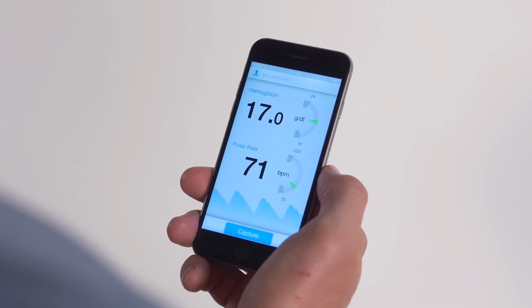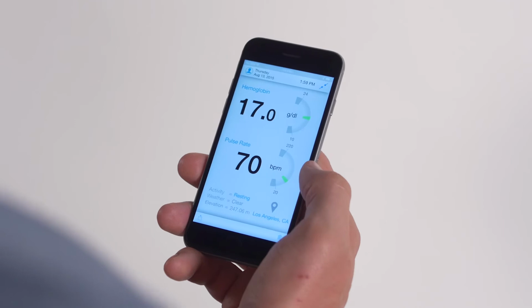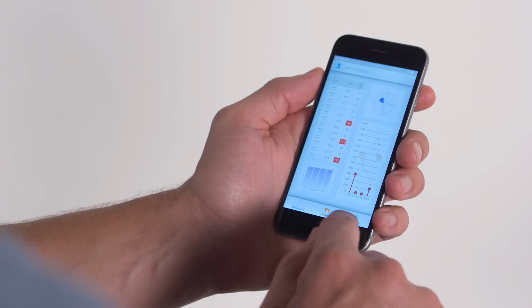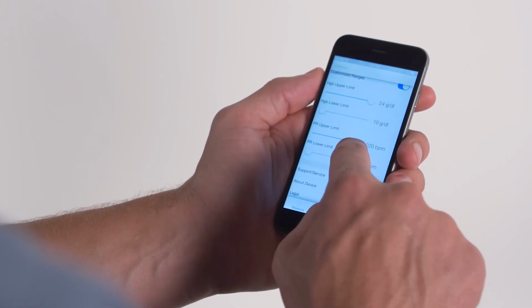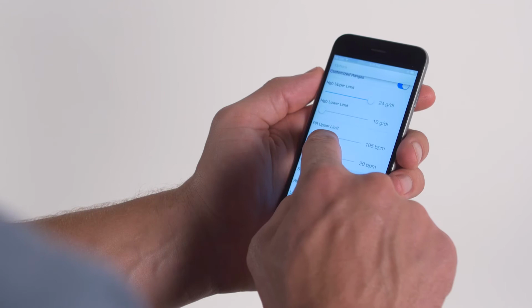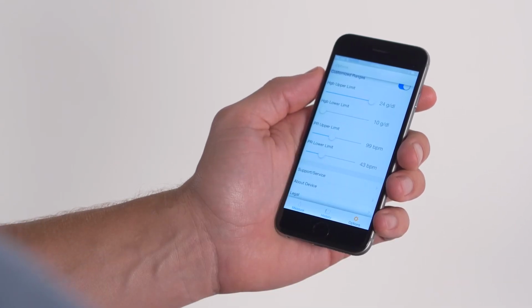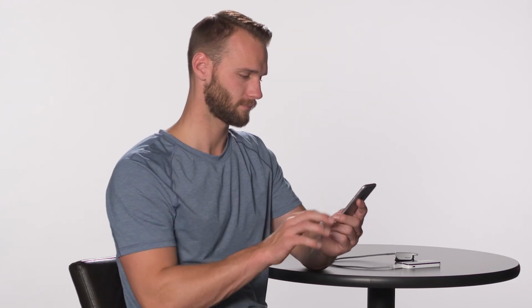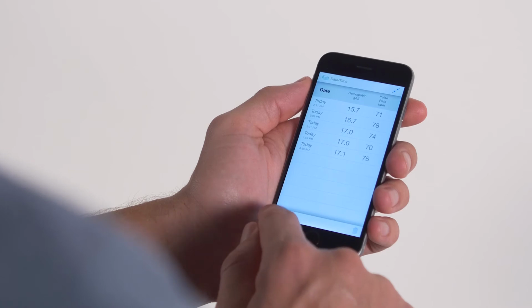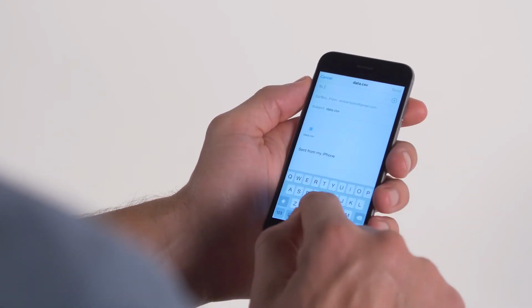Your measurement result values will display on the screen. When you tap the capture button, those results will be saved in your history. The gauge to the right of the display tells you your target range based on your age and biological sex. You can customize your ranges to fit your specific goals within the Options tab. Review your entire history table or filter to just the dates and activities you want. Then share these specific measurements as a CSV to take it into your other training software.